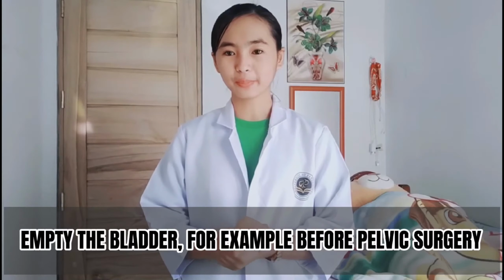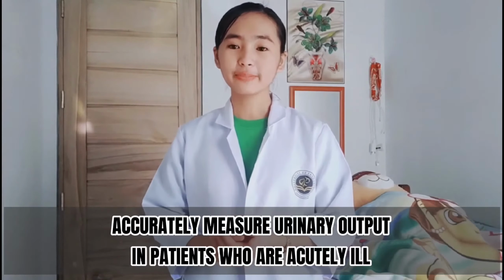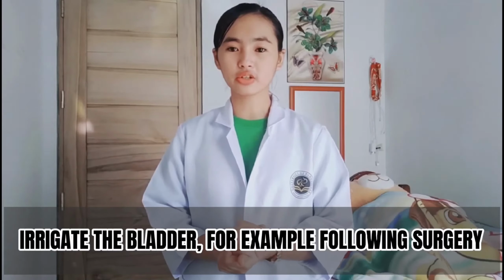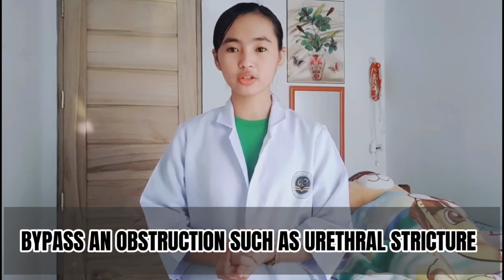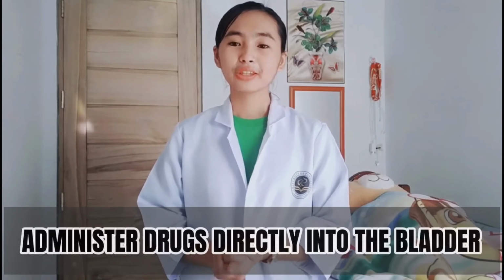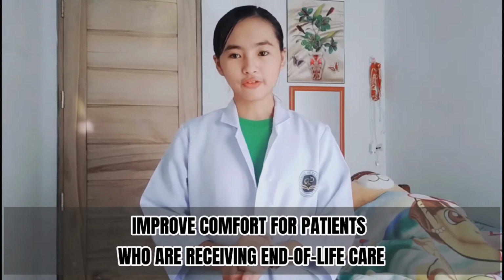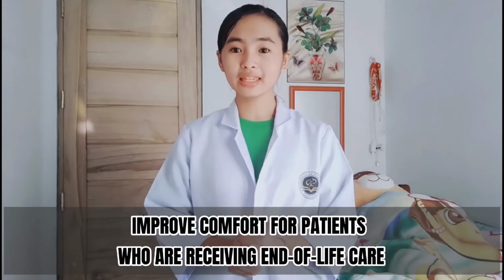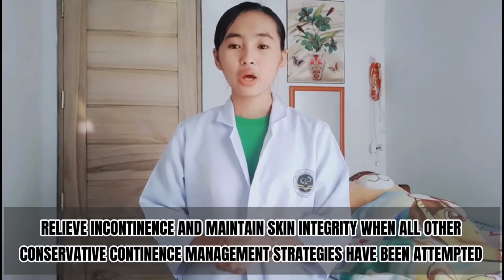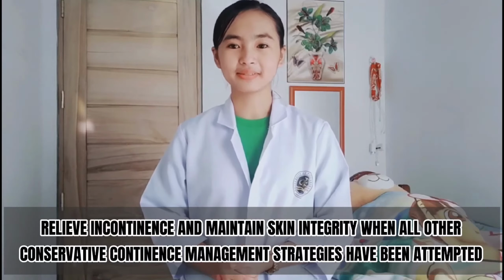the bladder, for example before pelvic surgery, to accurately measure the urinary output in patients who are acutely ill, to irrigate the bladder, for example following surgery, to bypass an obstruction such as urethral stricture, to carry out bladder function tests, to administer drugs or medications directly into the bladder, to improve comfort for patients who are receiving end-of-life care, and to relieve incontinence and maintain skin integrity when all other conservative continence management strategies have been attempted.